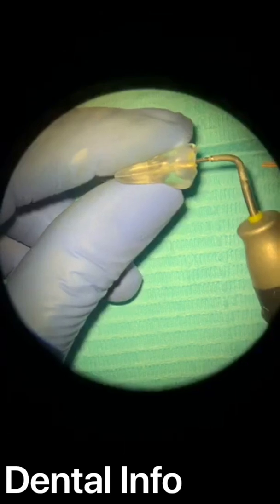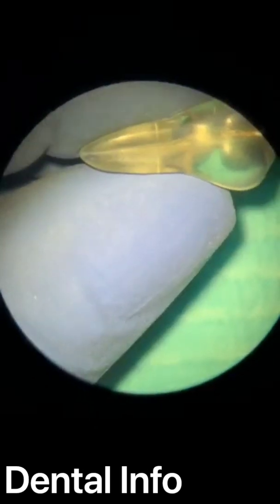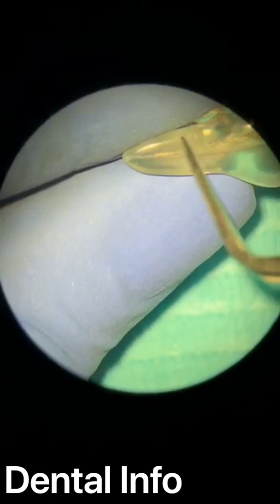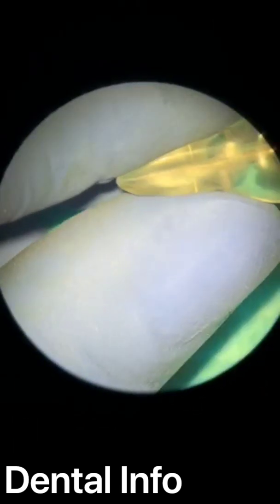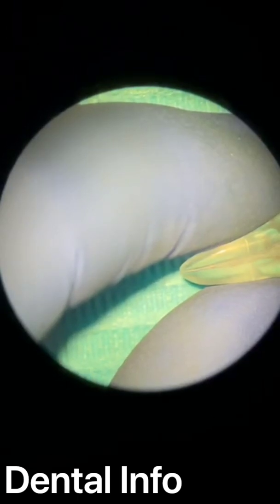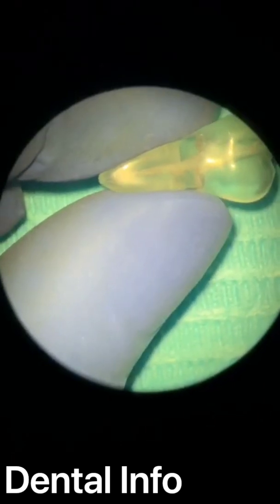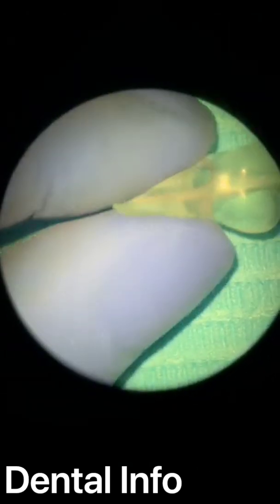For me, this fit is very good. See? Here is very good. Of course, I'm not pressing anything here, just making the fitting. So, it's here. I have about 3 millimeters here. It's good for me. With severely curved canals, we will cut just to the curve, or we can use the smaller one, the black one, but we have to be careful with curves, because maybe if you don't have enough experience, you may break the tip in the canal, and you will have to manage that. So for me, the yellow one is good.